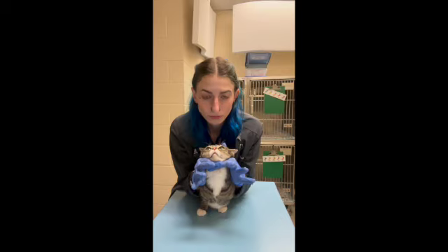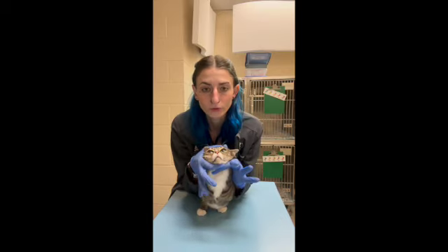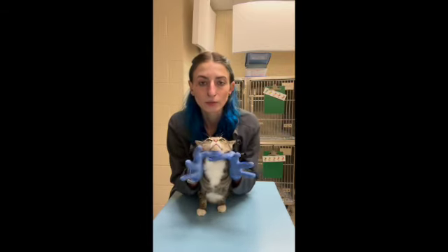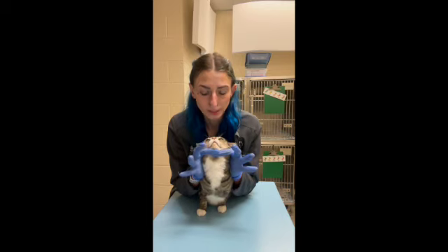You can also do another way, where you hold their head in between your fingers, and you can hold their front limbs too if they start being a little bit unruly. But typically I like to go for under the chin and behind the head to help secure her head. And then the person drawing blood would be able to hold off at her thoracic inlet and draw blood that way.